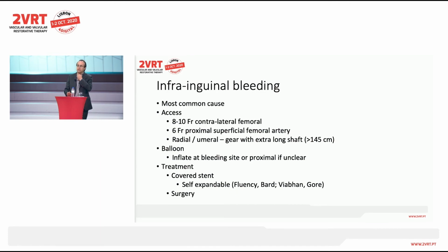You don't see the balloon expandable stents on this list on purpose, because if you put a balloon expandable stent on a femoral, the femoral is a flexion point, the femoral is a compressible point from the outside. So the first time you're going to see if the patient has a pulse on the femoral, you're going to compress the stent. Nothing may happen, but I don't know if it's a good solution. So really the options will be a self-expandable stent, as we talked about, or surgery.